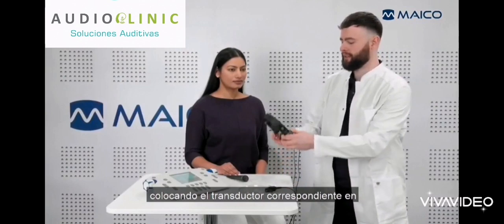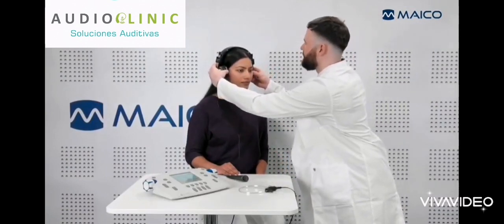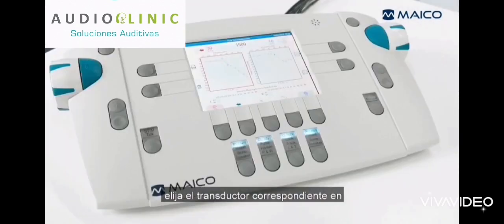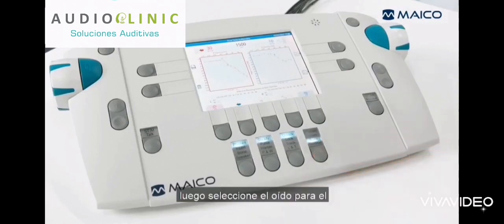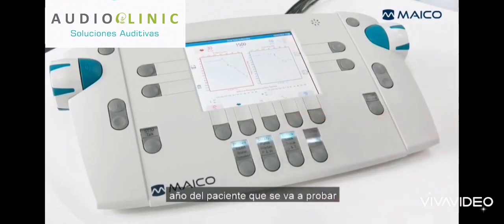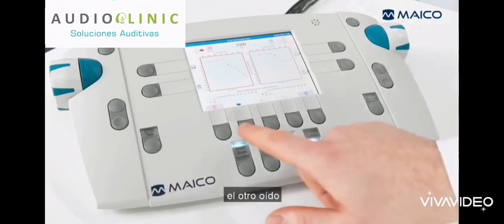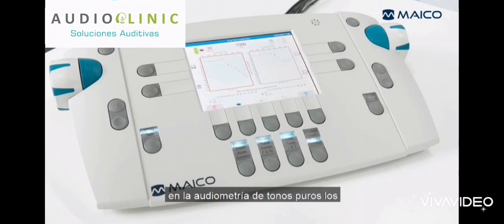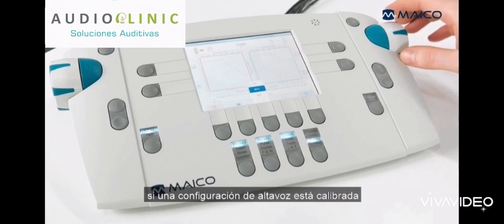Prepare the patient for the test by placing the corresponding transducer on the patient. Choose the corresponding transducer on the device. Then select either the ear for the channel or the test signal for the patient's ear to be tested, and if necessary, the masking signal for the other ear. In pure tone audiometry, the test types HL, MCL, and UCL are available.